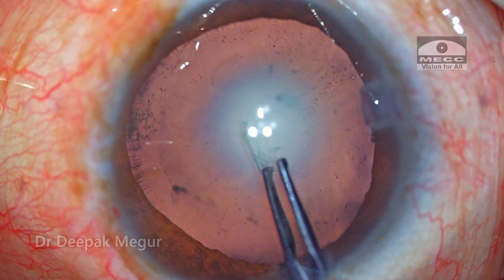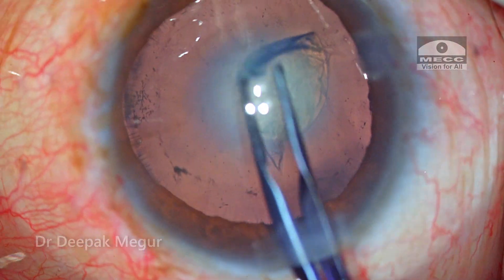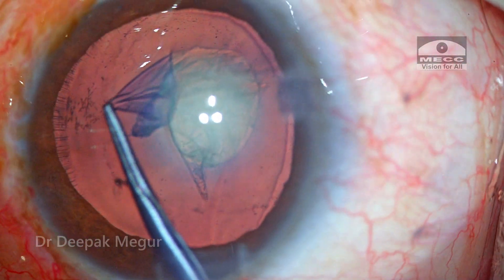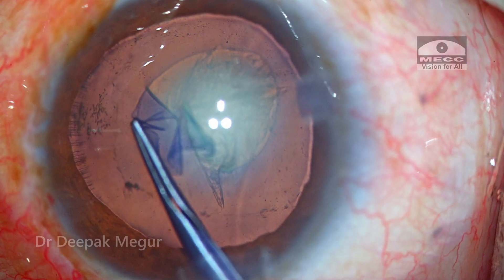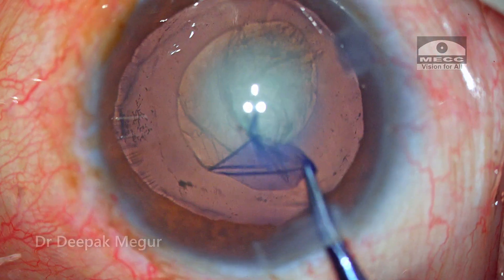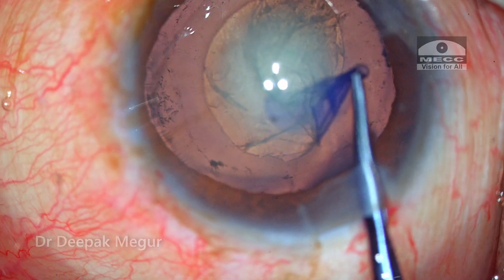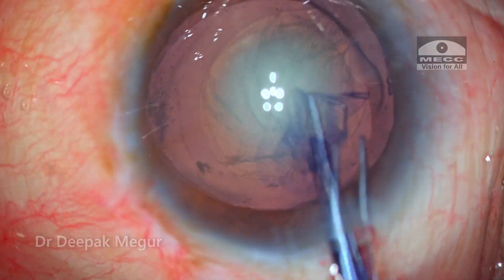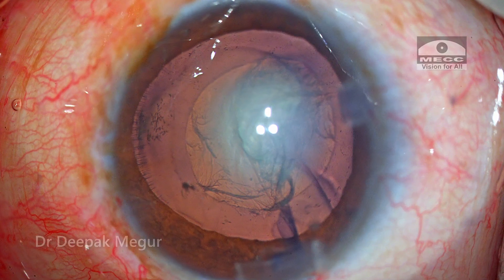I'm quickly switching to my forceps, and as I'm tearing I can see some folds adjacent to the tearing edge but they're not severe, indicating the zonular health is alright. In this situation I can plan to postpone insertion of the CTR to a slightly later stage of surgery. I'm aiming for a rhexis of about 5 mm, centered to the visual axis and not to the pupil, because the pupil is slightly oblong and dilated more towards one side. The rhexis is now quite well centered and adequately sized.